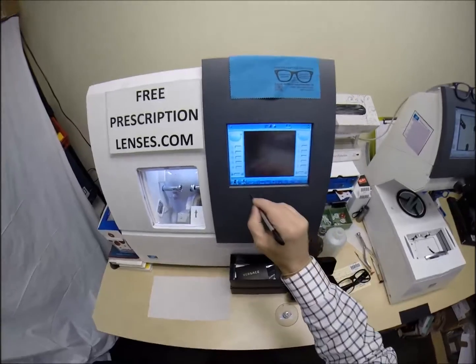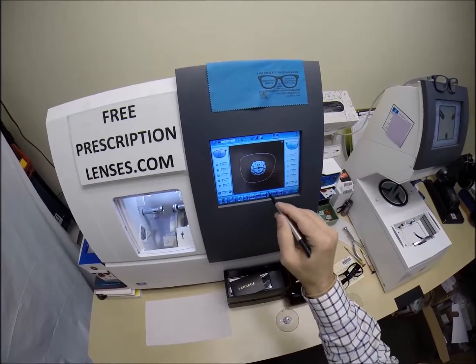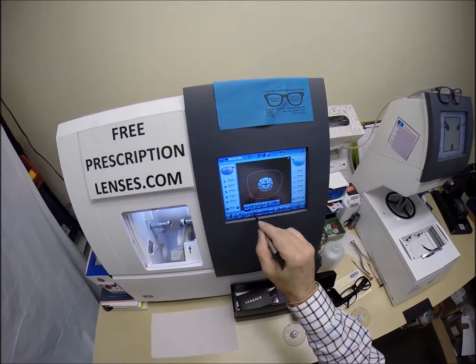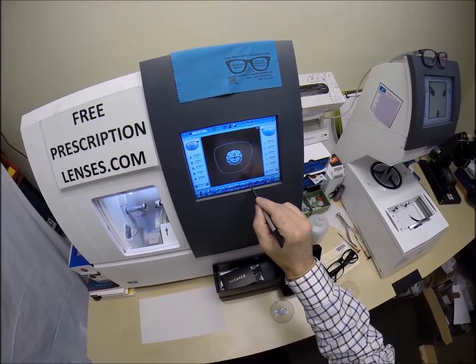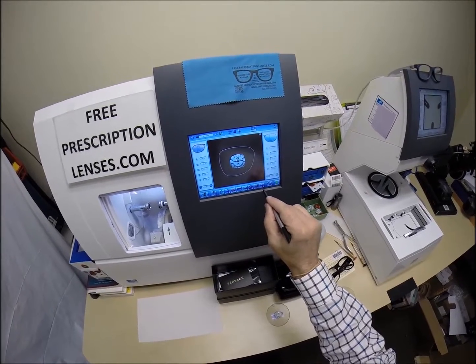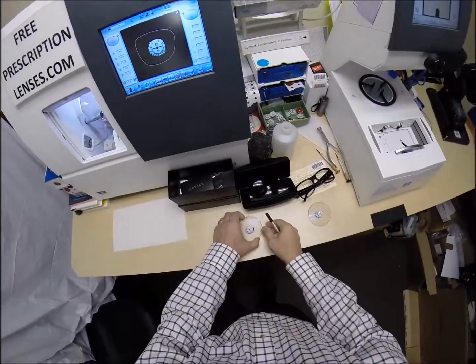So let's go ahead and pull up the shape we'll be cutting. It's telling me that only one lens had been blocked. That's because I redid it. That is the shape. Now these are polycarbonate lenses. They were plastic, high index plastic, or Trivex. I would select that. I'm not going to polish the edge of your lenses because it's not going to be seen anyway. I'm not going to put a bevel on the front convex surface of the lens. I'm only going to put one on the rear concave surface of the lens.